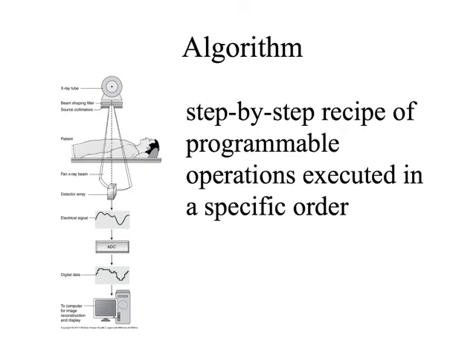So we'll go back to this real quick, but an algorithm, again, as we've illustrated in abundance, is a step-by-step recipe of programmable operations executed in a specific order, and we might add to that, it has an end. It ends. It doesn't just keep on doing it.